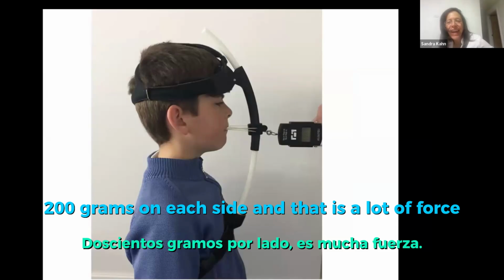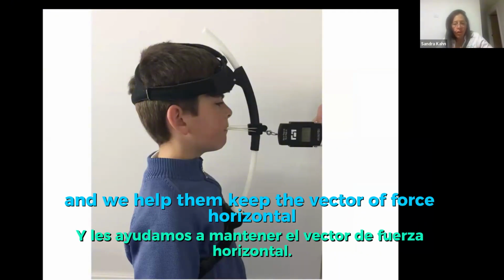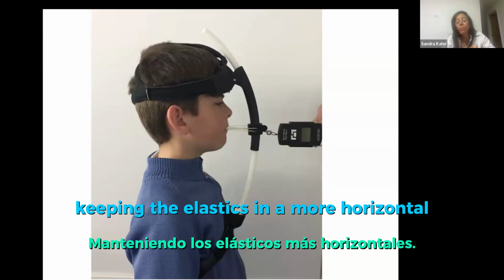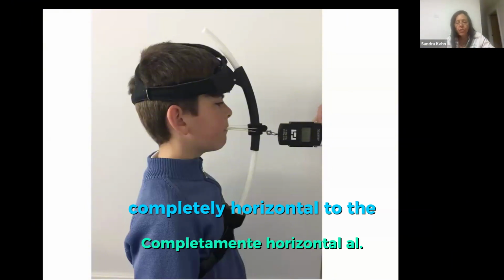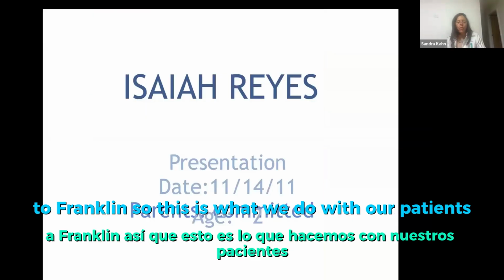And that is a lot of force. And we have the patients vary the force so that they're comfortable, and we help them keep the vector of force horizontal to Frankfurt. So we want them to try to use this appliance, keeping the elastics in a more horizontal direction. If we look at the protocols of using face masks, the vector of force is always down, about 20 degrees down. We like to have it completely horizontal to the mandibular plane, to Frankfurt. So this is what we do with our patients.